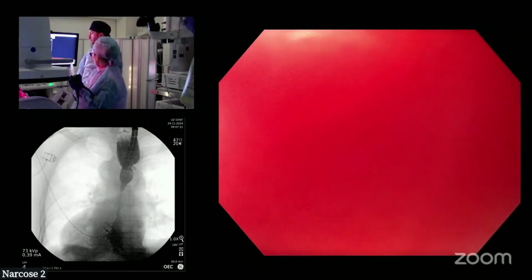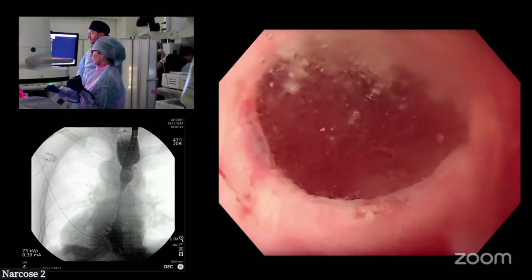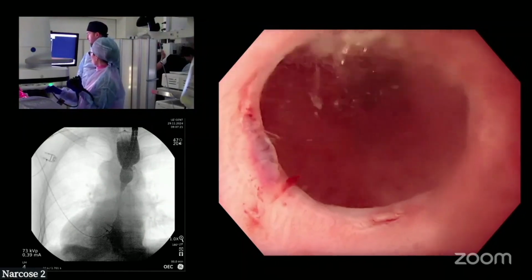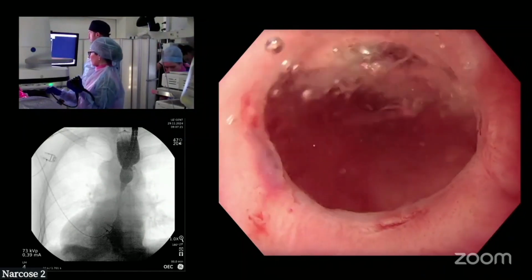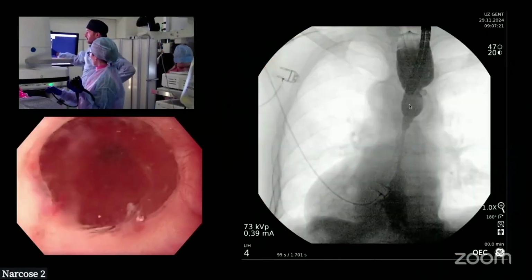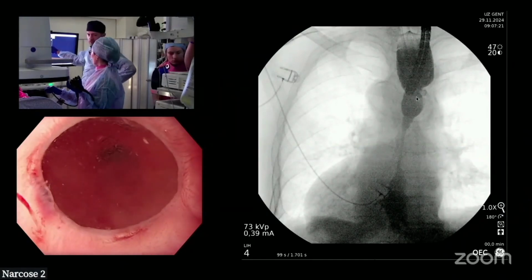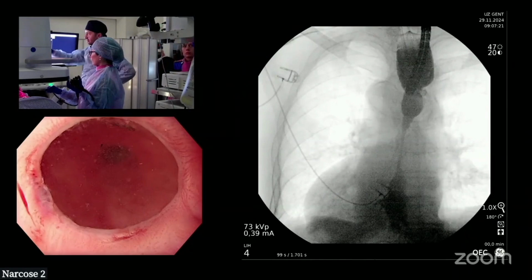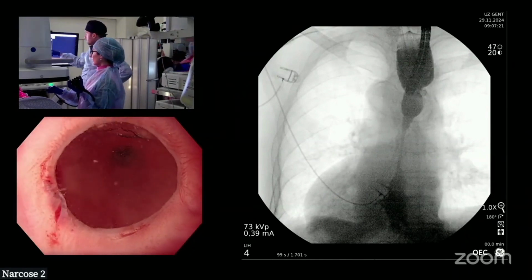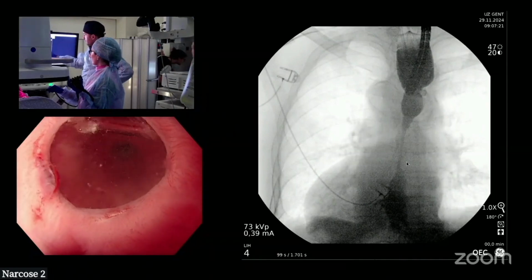Okay. Yeah. So let's just consider the X-ray image. Maybe, Carrie, you can prioritize the X-ray image for a second. When you're looking at the X-ray image, there are some features. I can point on it. So here you see where my mouse is, the tip of the endoscope, right? And you can see endoscopically, it's sitting on that stenosis. Then you can see that below it, there's a little distance until we get to this quite annoying looking thing.